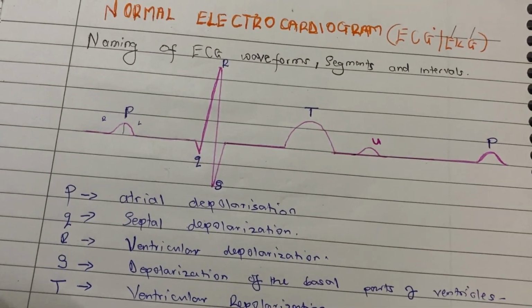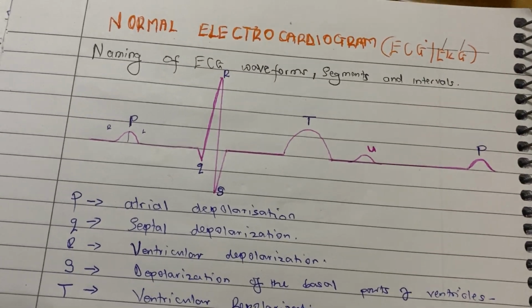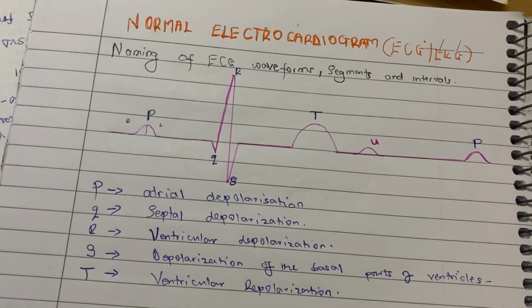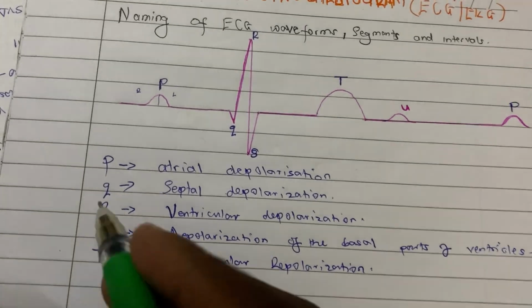So next, what are the segments? How do we define a segment?